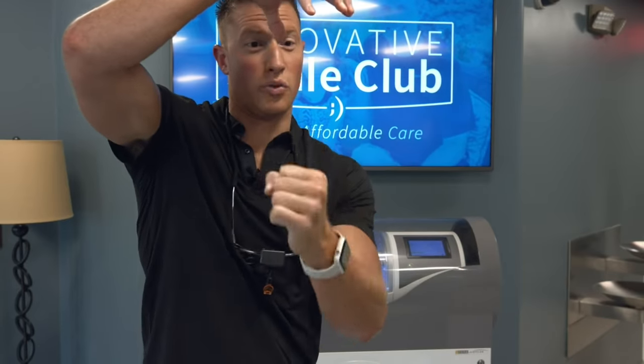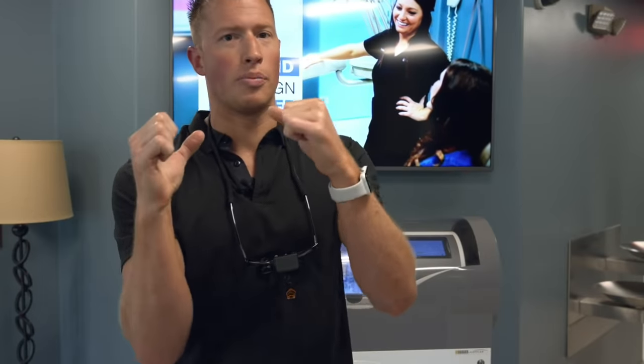So we didn't do something like this or something like that, or even worse, like that or that. And I don't know if you can see that. So different angles with that future crown cause a problem for when the patient chews, it's going to want to torque or put an awkward force on that crown. Those torquing forces or awkward forces can cause the screw that holds the crown in place to break. They can cause damage to the implant.